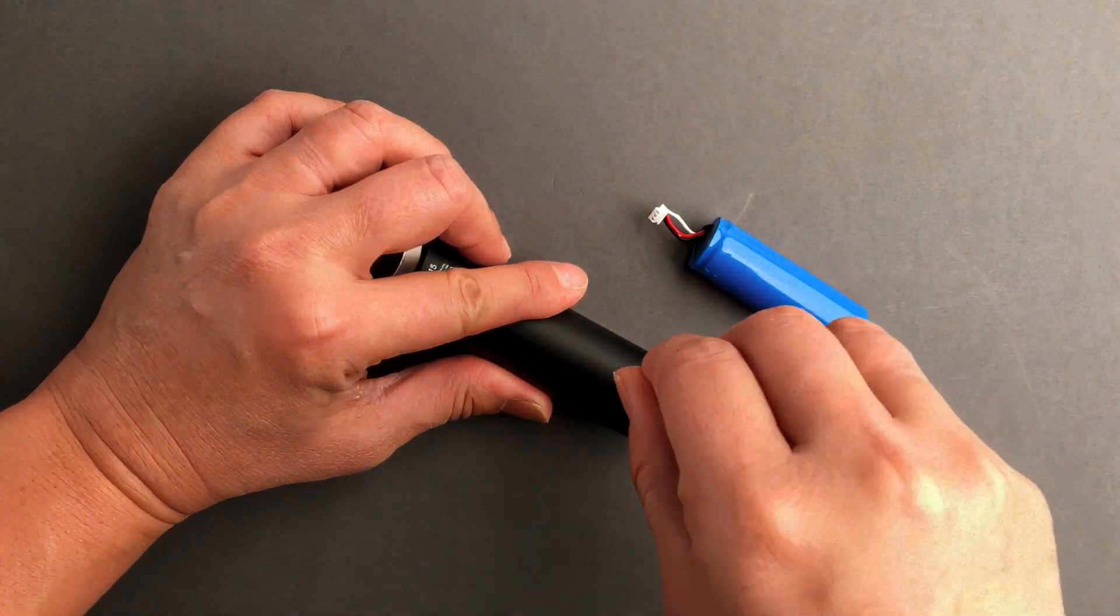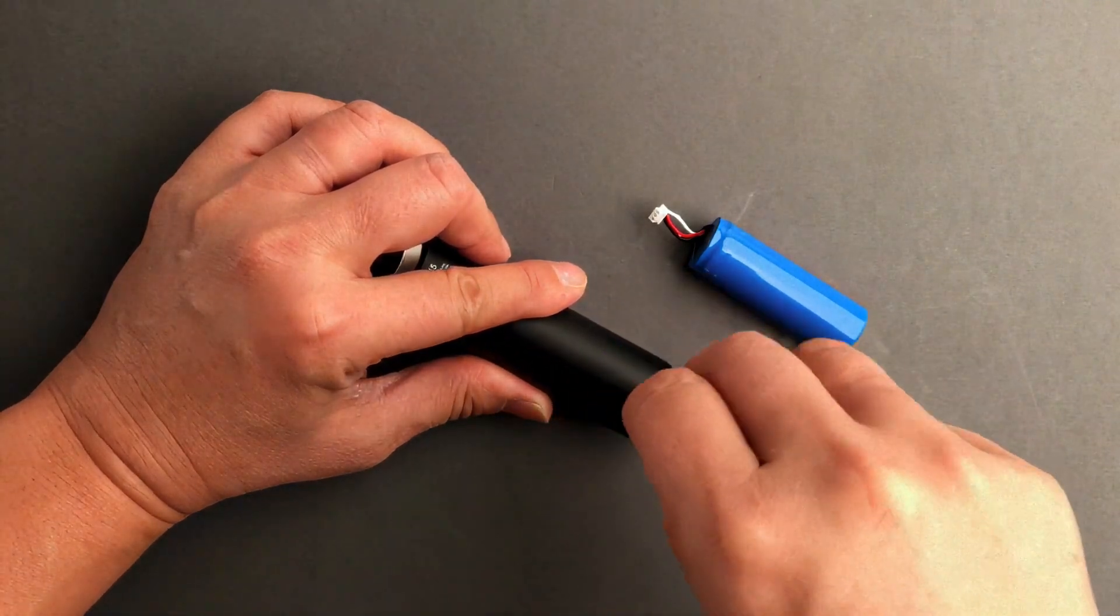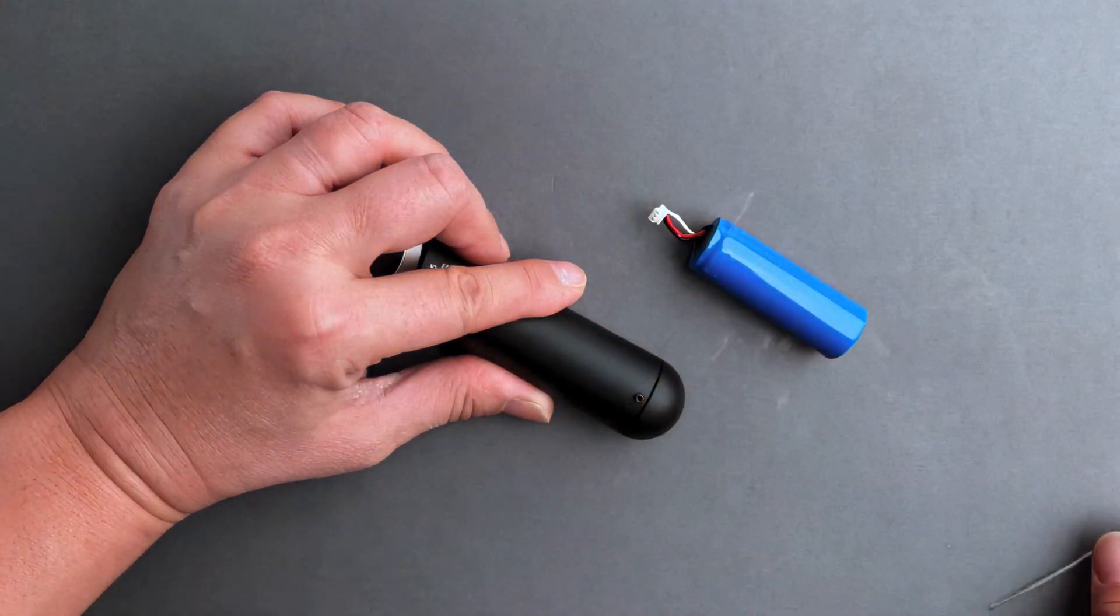Then using the Allen key, you'll loosen the set screw that holds the battery cap in place. It's not necessary to remove the screw completely.